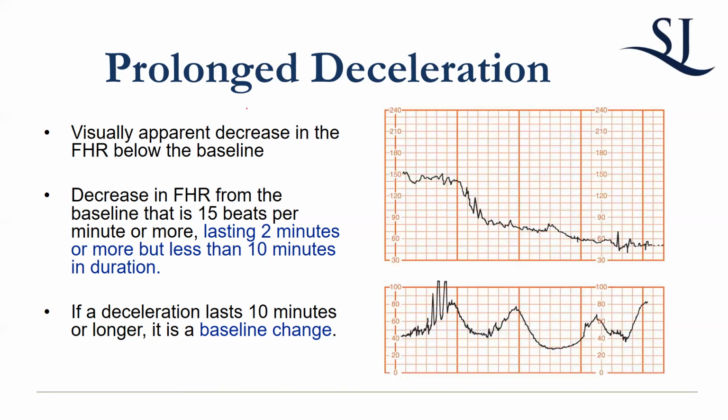Prolonged decelerations are pretty much what I mentioned, if it exceeds 2 minutes, but your prolonged decelerations usually are a problem because they go out of range of normal baseline. It looks like this. So baby tanks. Again, you can see that the variability is actually fine, but this is not okay, right?